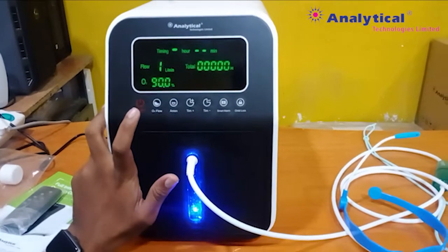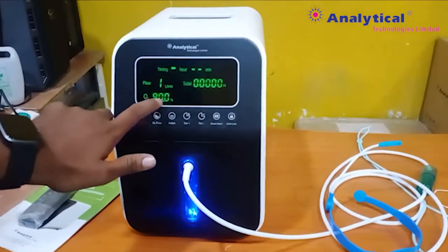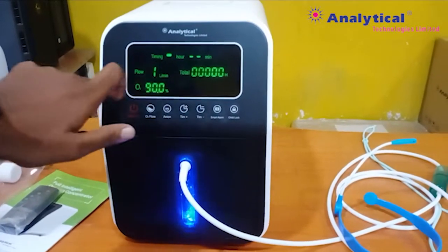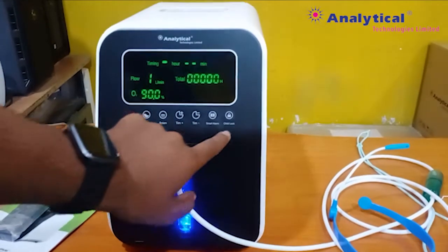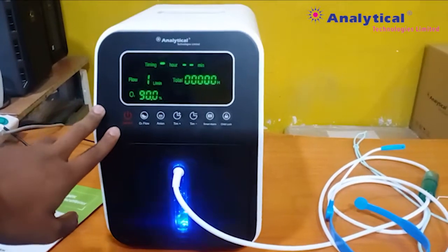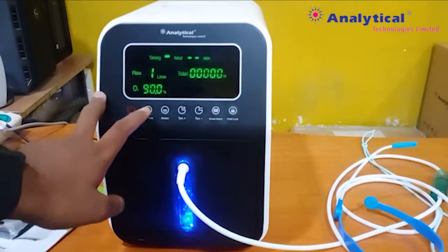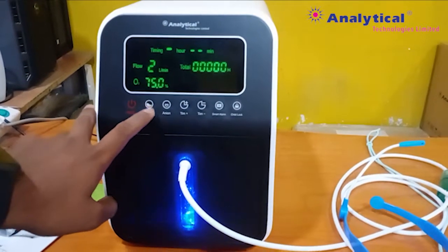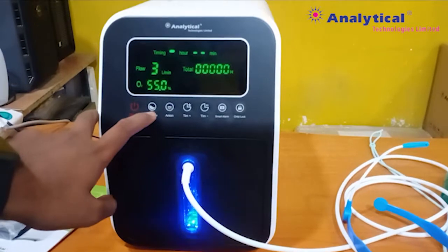This is the main display of the machine. You can see flow, percentage of the oxygen, time, and you can see the main function of the machine. The second one is oxygen flow. If you want to change the flow, then you need to press on this button. As per your requirement, you can see it here.